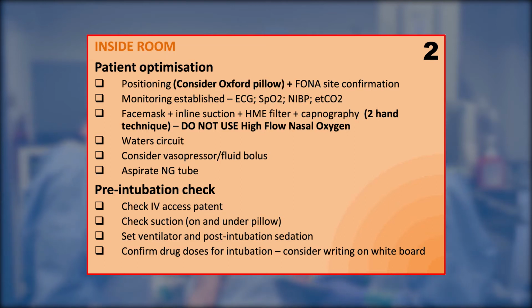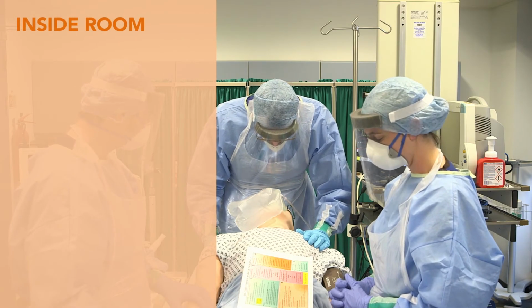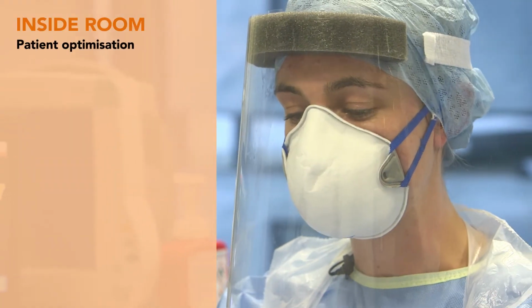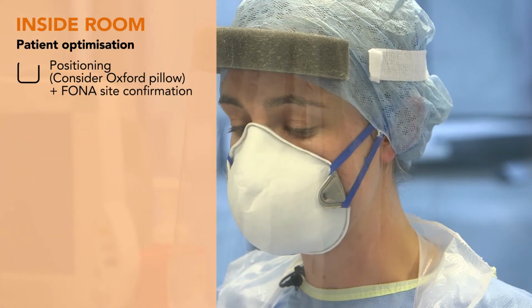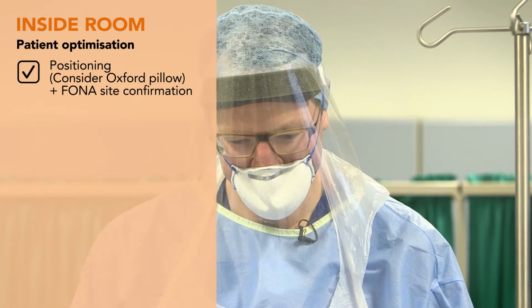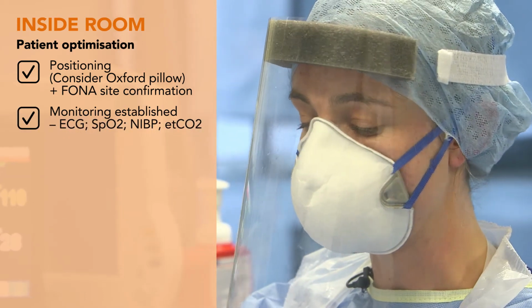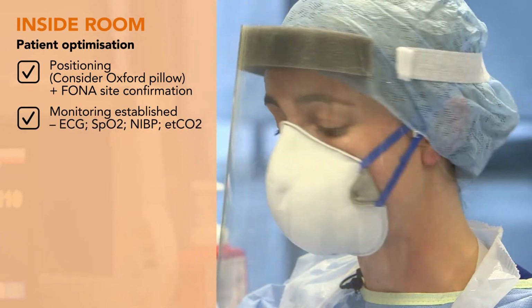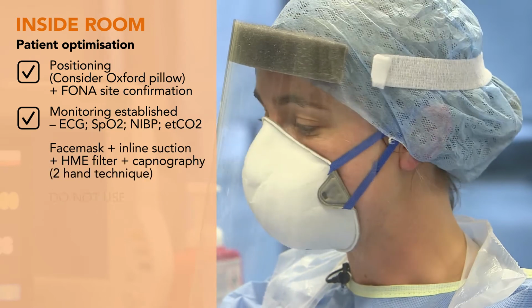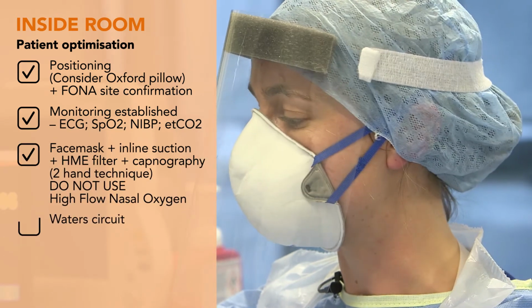Okay, so now we're going to go through the inside the room checklist. So we're just going to go through 3 checks before drifting off to sleep. Yep, so patient optimisation. So Ben, are you happy with patient positioning? Yep. And you confirmed front of neck access site? Yep, confirmed. And we've got our monitoring established, so we've got our ECG, we've got our SATs, we've got our blood pressure and our end tidal CO2. We've got our face mask, inline suction, HME filter, capnography and water circuit.